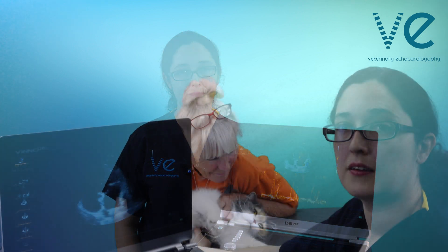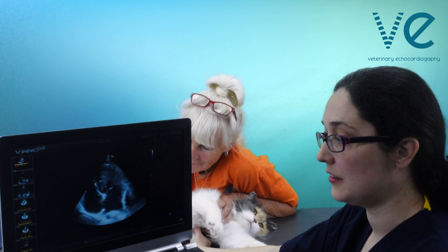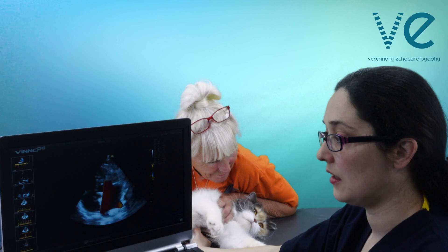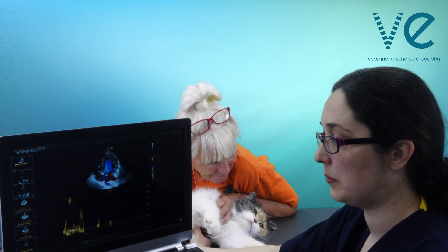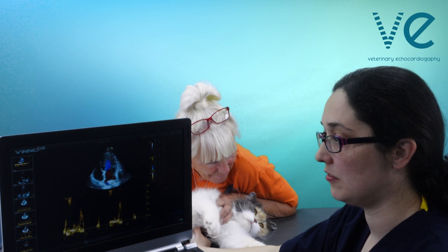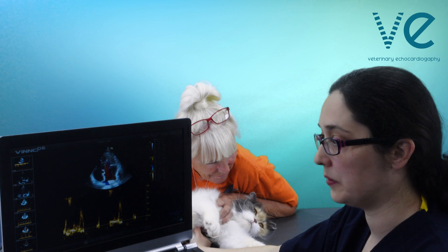In this video I'm going to show you how to take a good mitral inflow trace in your feline patients and how to perform your measurements from them. Getting a nice on-axis image, using colour to guide me, putting my pulse wave Doppler gate at the tips of the mitral valve leaflets in their open position and using my enter or update key to reposition it, I get my E and my A waves.